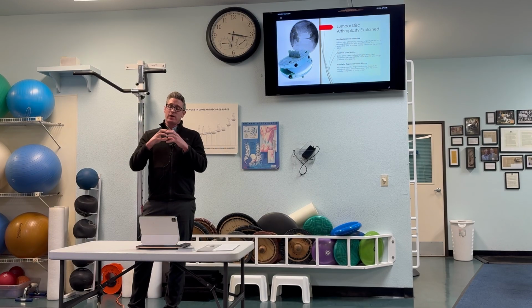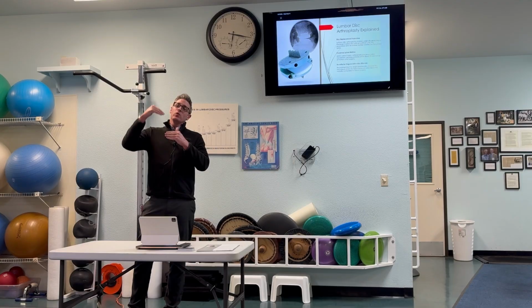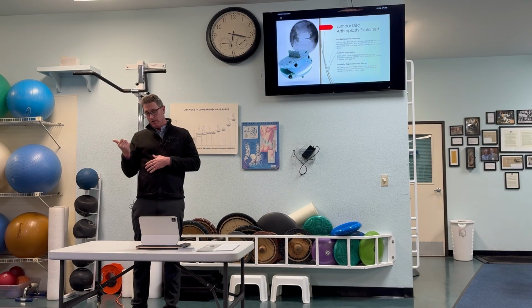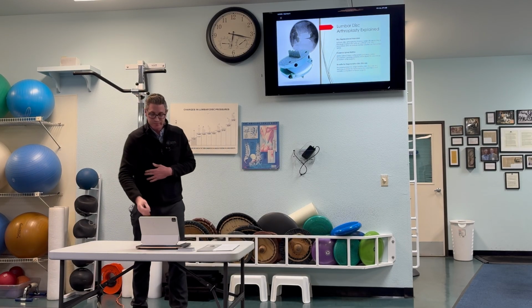So when we fuse the spine, the bones are linked together, and then those forces are transferred both above and below that prior fusion construct, and that can break that down, and then that's when we may need more surgeries in the future. Whereas with this particular procedure, that decreases the likelihood of that, albeit still present, but significantly less, and therefore less likelihood of needing additional level surgery or adjacent segment surgery.